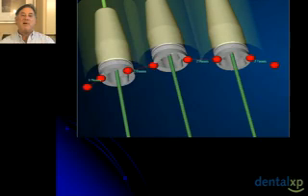So my first positioning, I got 2.8 implant to implant and 2.9 implant to implant. So I was pretty close right away. I could do one of two things. I could slightly move the implant distally and get a little bit less next to the adjacent tooth, or I could change the size of the implant.